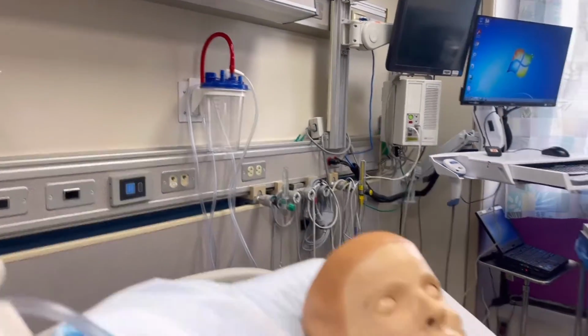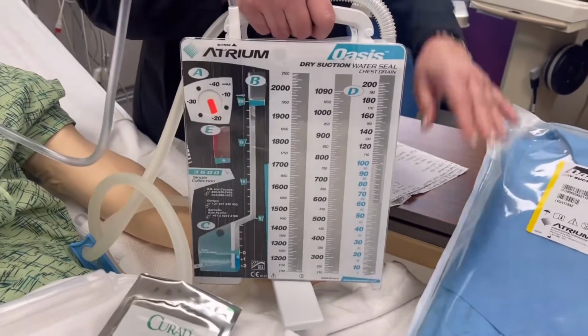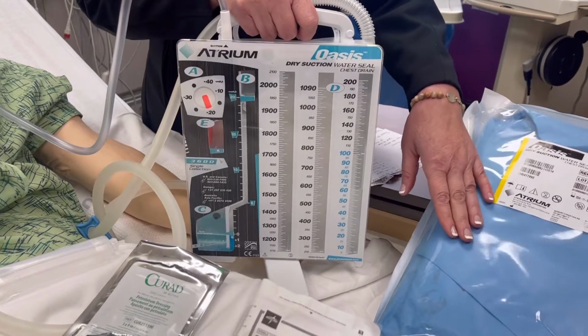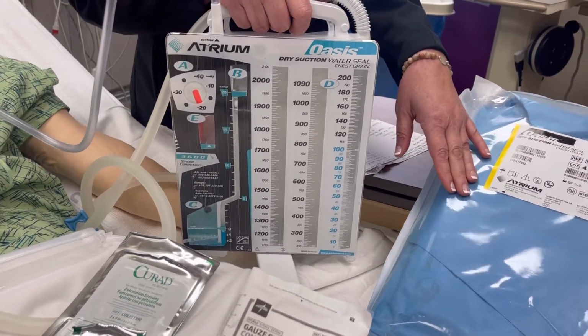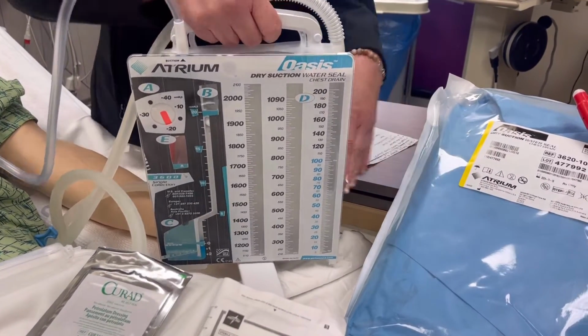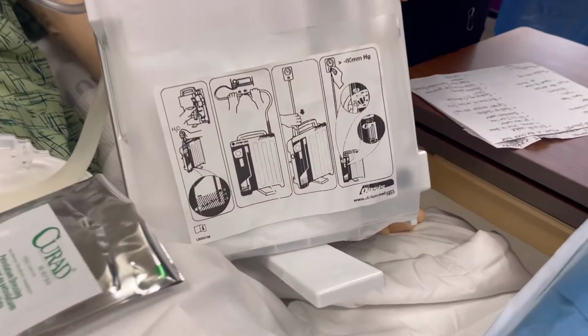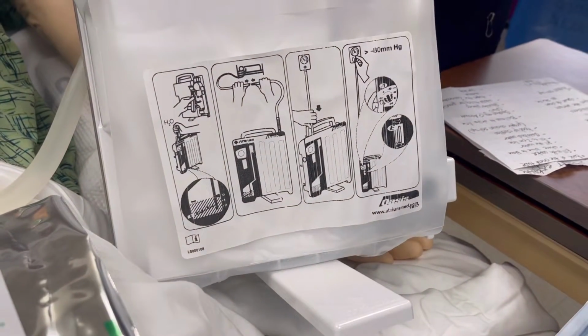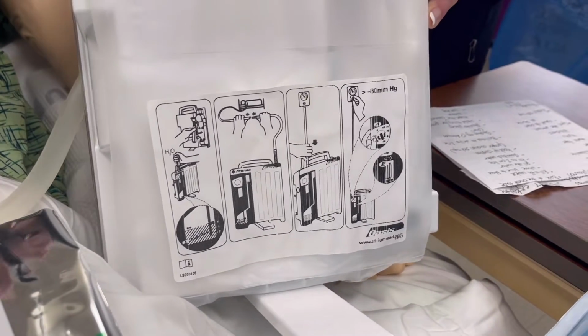When you open up your drainage system, you'll note that it's wrapped in blue. It is not sterile, it's clean, but needs to be managed at one point in a sterile fashion, and we'll talk about that. On the back of the Atrium device, if you forget the steps, it very clearly will show you the steps in setting up the Atrium device.